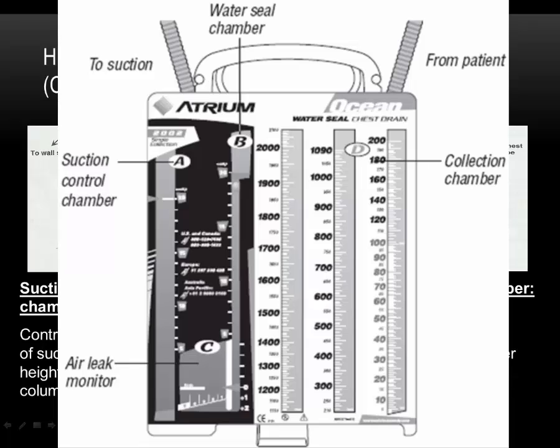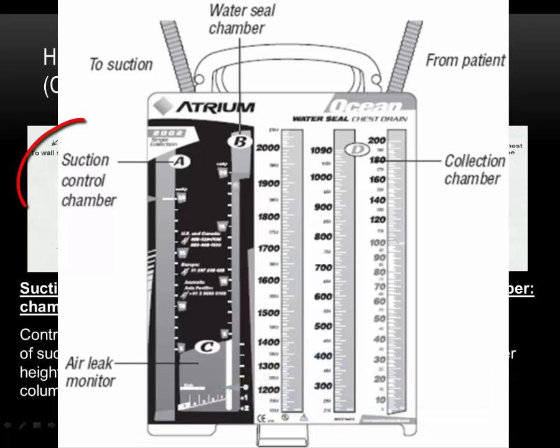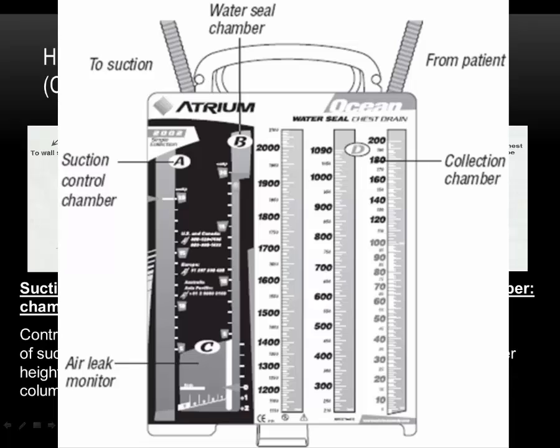You'll need a vacuum gauge and tubing ready to apply suction to the CDU. Start by filling the water seal chamber to the level specified by the manufacturer, usually to the 2-centimeter mark. Next, fill the suction control chamber with sterile water to the 20 centimeters of water level, or as ordered. Keep in mind that the water level in this chamber determines the suction level, not the amount of vacuum applied from the vacuum gauge to create the negative pressure that draws air in and out of the pleural space.